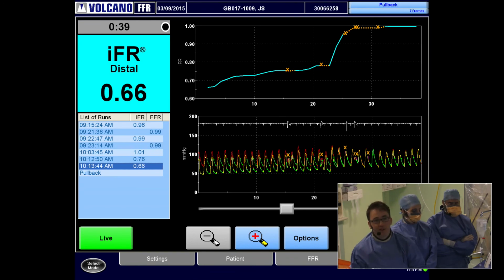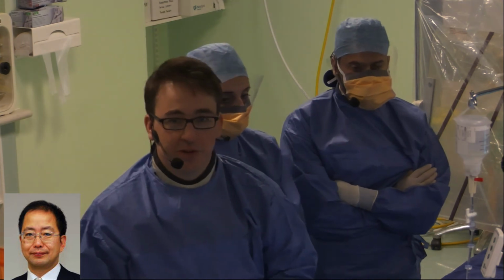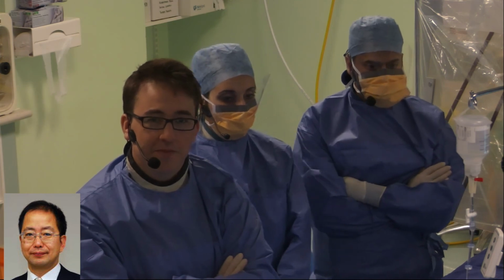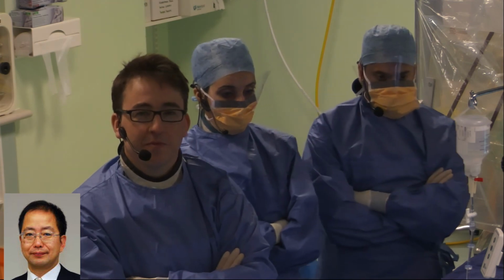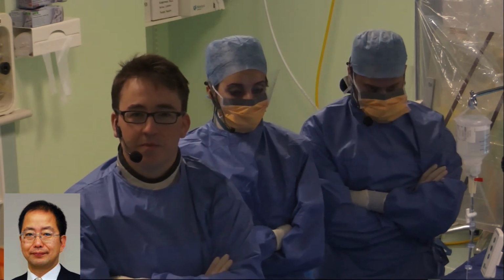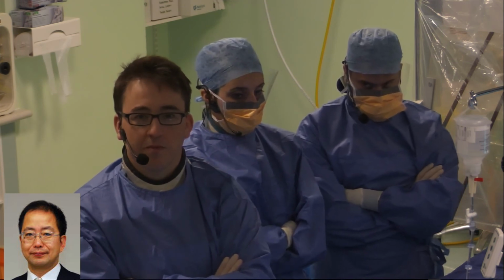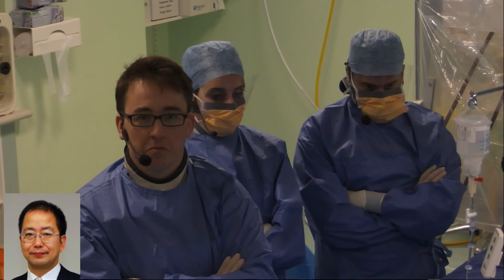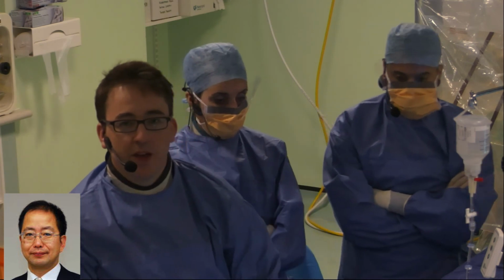So, Hitoshi, we've got about 3 or 4 minutes left. I'm not sure if there's any questions which you've got for me, or anything you'd like to address to the Japanese panel. Yeah, there is one question from the audience. This is a question about the normalization of this system. Usually, as for the measuring of the FFR, normalization is just done once. However, in usual practice, as for the IFR, we usually do more than 2 times normalizations. Is it necessary, or do you think 1 time is enough for the normalization?